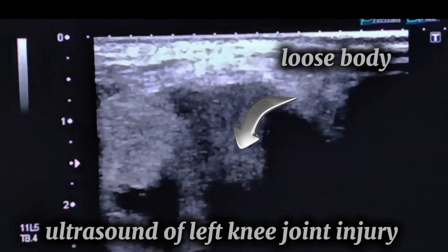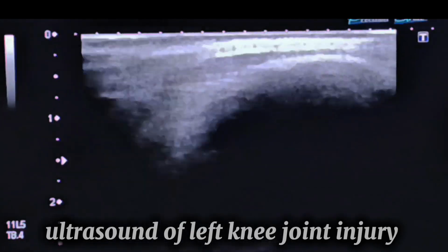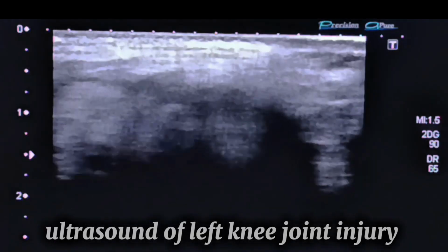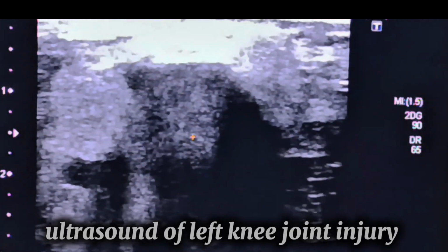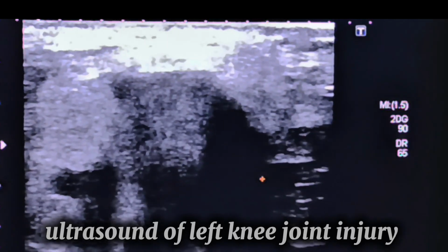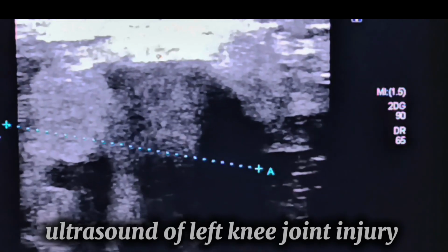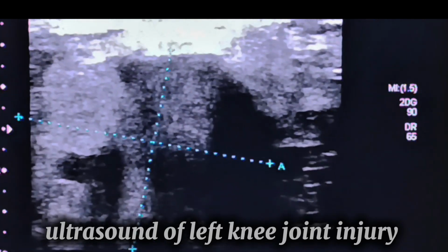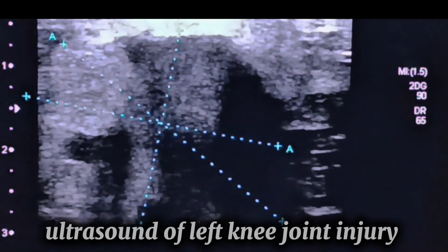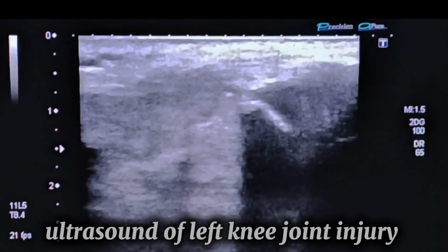No adjacent erosion or meniscal displacement was noted. Mild synovial thickening is observed surrounding the echogenic loose body. Normal vascularity on Doppler and gray scale shows no gross hyperplasia. Lateral meniscus appears unremarkable. No clear evidence of tear was seen. Mild synovial thickening suggests post-traumatic or reactive synovitis.